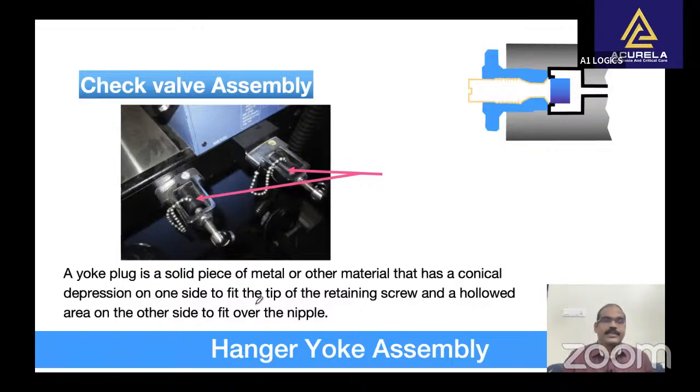If a full cylinder is not available, a yoke plug should be placed in the empty yoke. When in place, the plug forms a seal to prevent the gas from escaping from the machine. In the absence of a yoke plug, gas can flow retrograde through an open flow control valve and out through the yoke.